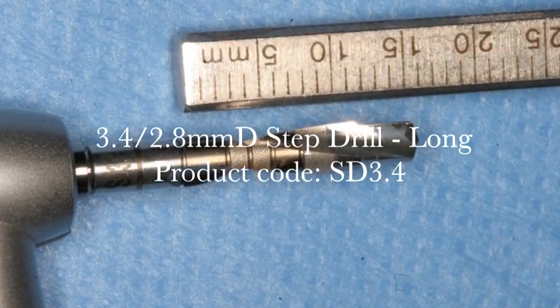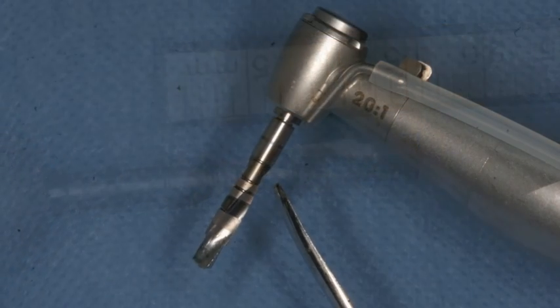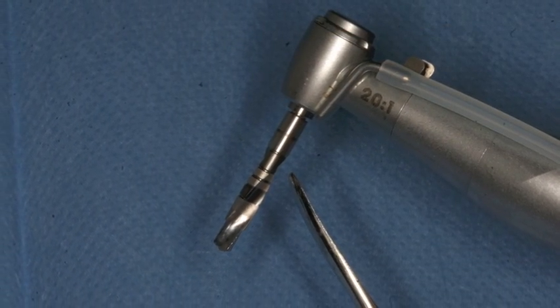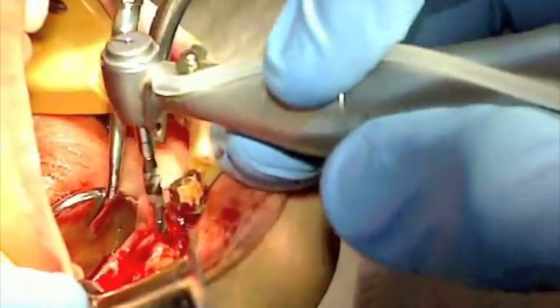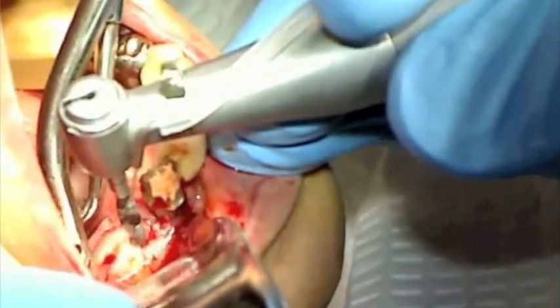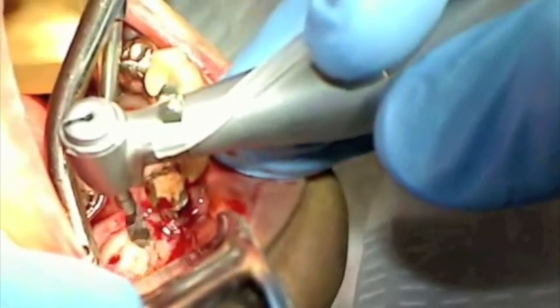The final sizing of the osteotomy is completed with the 3.4-2.8 step-down drill. Using tactile sensitivity, you can control pressure and speed of the drill to avoid damaging the bone during this final phase of osteotomy preparation.